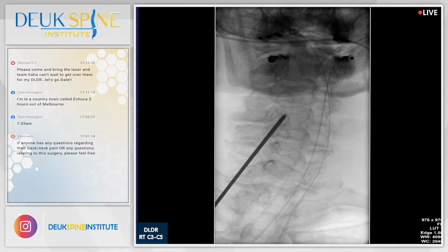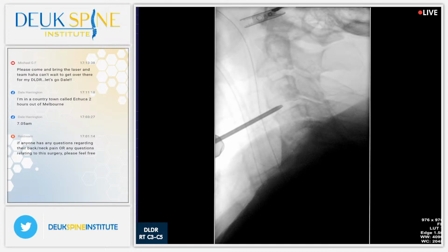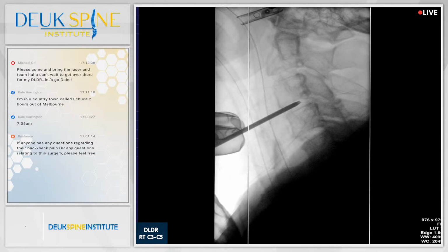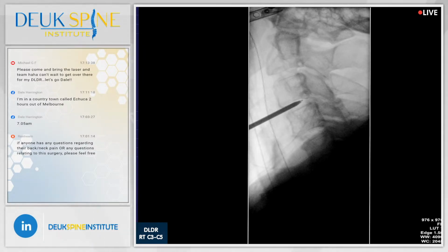Lateral. He's got some arthritis in his facet joints. I don't know if you guys can see that. Jordan, show them on that view. Henry, keep it on the x-ray view. Copy that. See the arthritis there? And look at the bone spur there laterally. Yeah. And the one up there. Yep, that big bone spur. Those are all bone spurs. So I'm surprised he doesn't have facet pain, but he doesn't. He just has this disc problem. Hopefully he never develops facet pain. We never know who's going to have facet pain. We can diagnose facet pain if they have it, but if they don't have it, we can't predict who's going to get it.